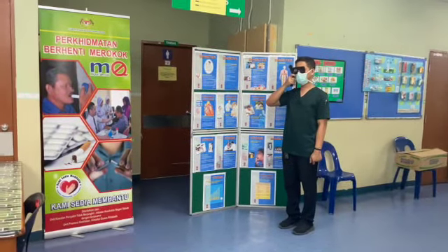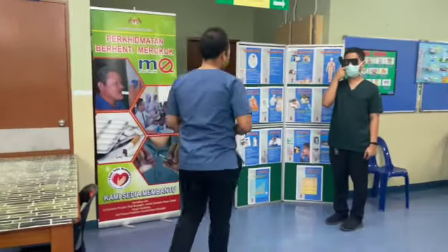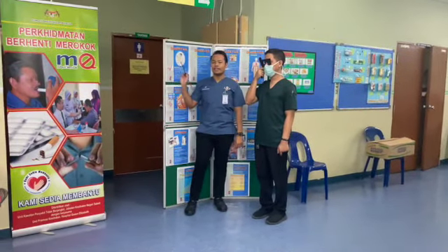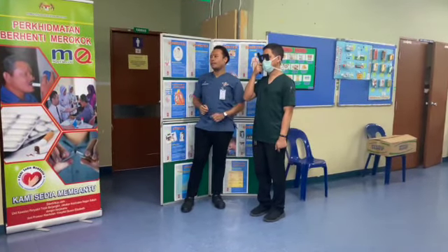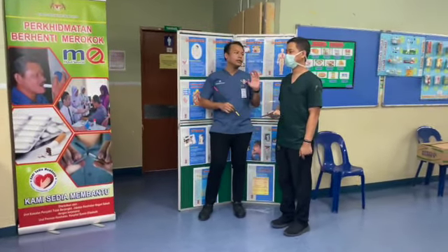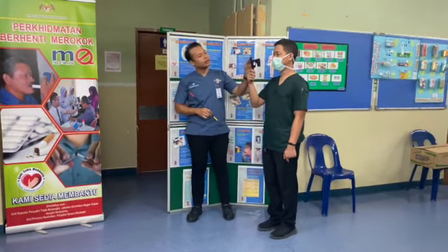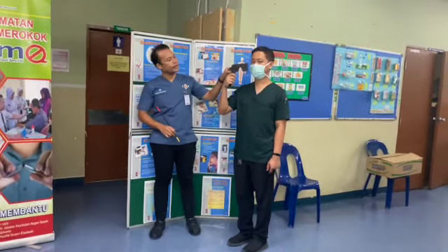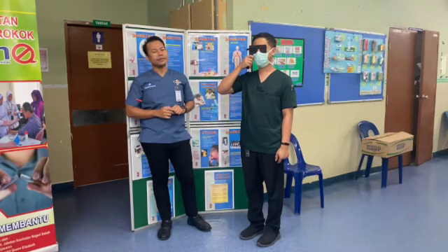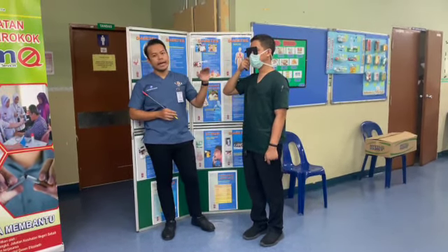The patient can be tested without the pinhole first, and then the examiner will ask the patient to read from the top to the bottom of the Snellen chart. But if the patient is unable to read the Snellen chart, we need to adjust the pinhole. We close the pinhole, then the patient should be tested with the pinhole. Then the same procedure with the next eye.